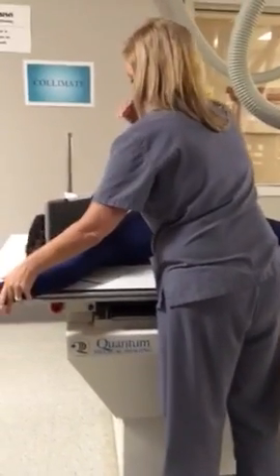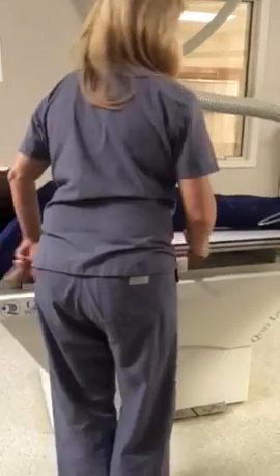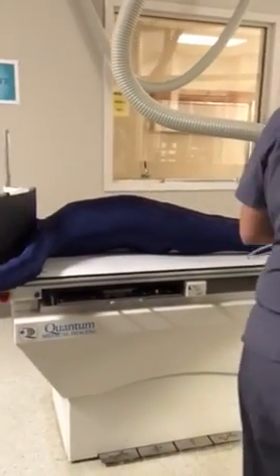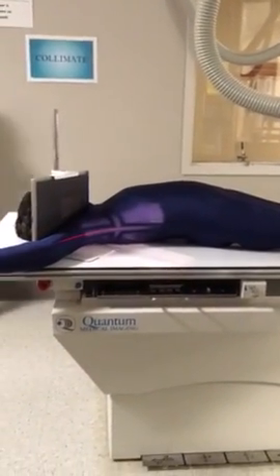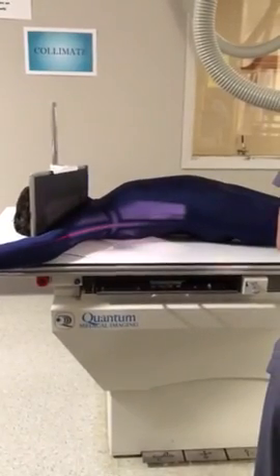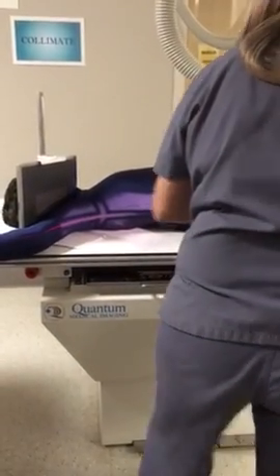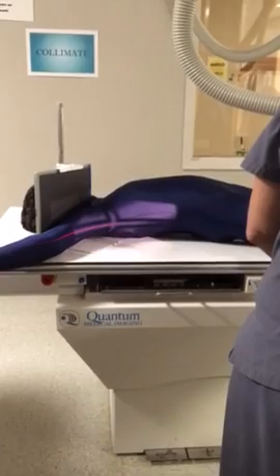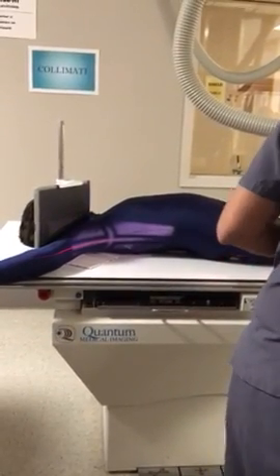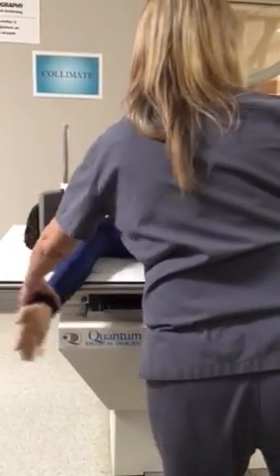You want their arm up. Always get them to bring their elbow around the image receptor. You can build them up. She probably needs to be built up. So that's inferior to superior. Everybody good with that? Mm-hmm.